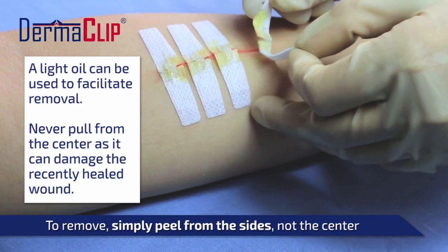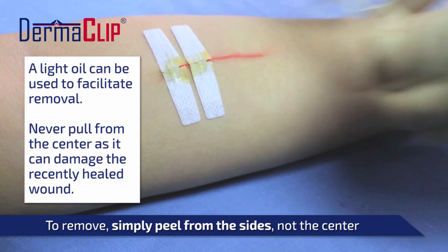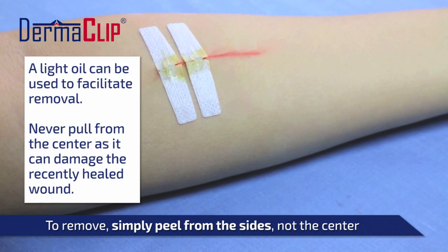In removing the device, peel — don't pull. The device should be peeled from one side of the closed wound to the other, so as to carefully remove it from the skin. Never remove the device by pulling, as damage to the healed wound may result.